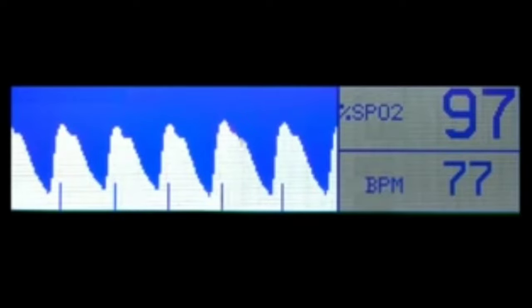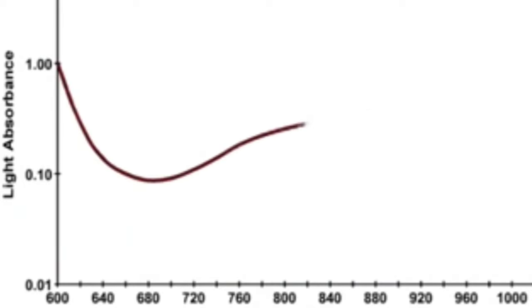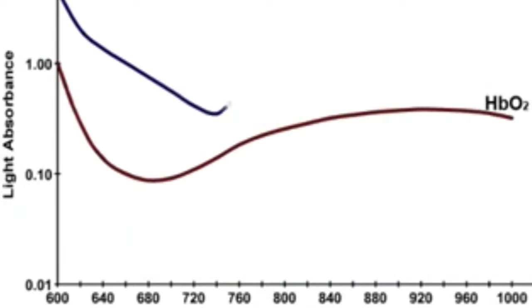Here's a graph that basically shows you the saturation — 97% or close to that is normal, anything below that is danger, and 80% saturation is severe hypoxia.